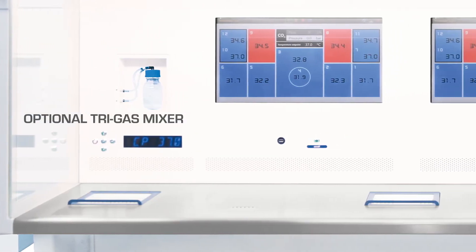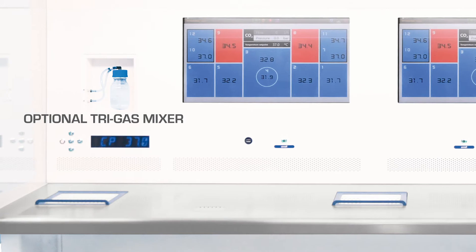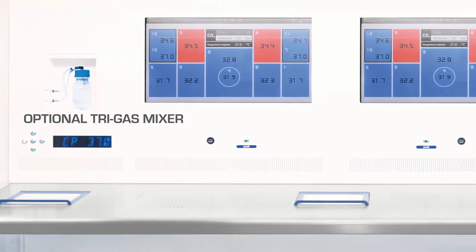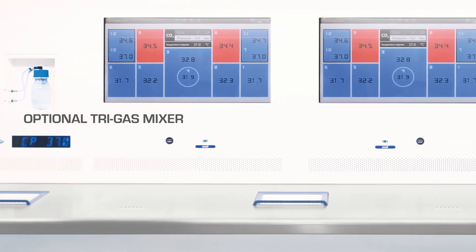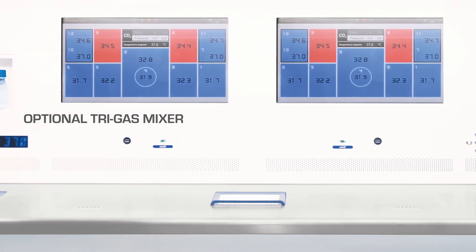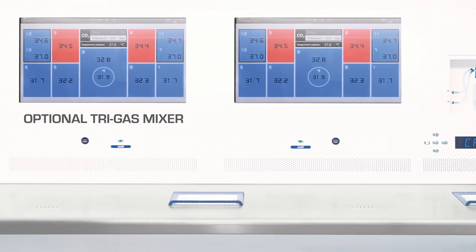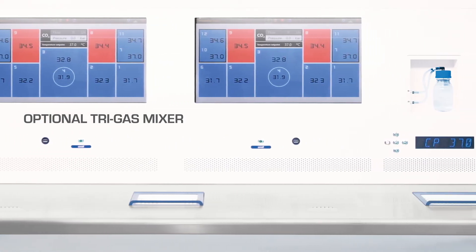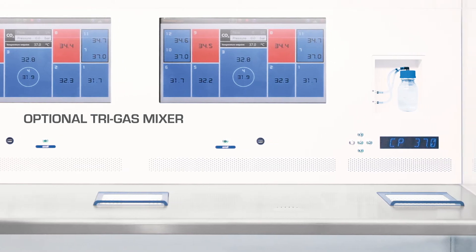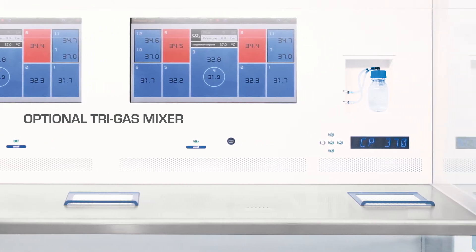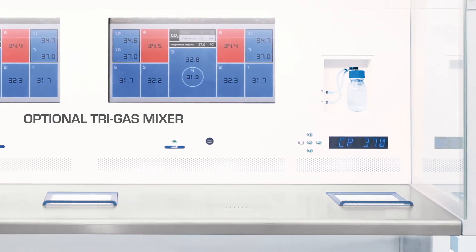Hence, you have an option to integrate a tri-gas mixer in the workstation to pave the way for utilization of pure nitrogen and carbon dioxide gas, a great way to save cost in the long run.